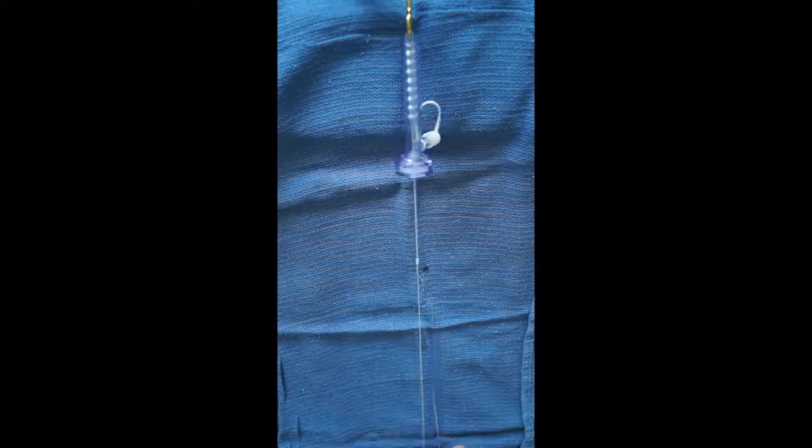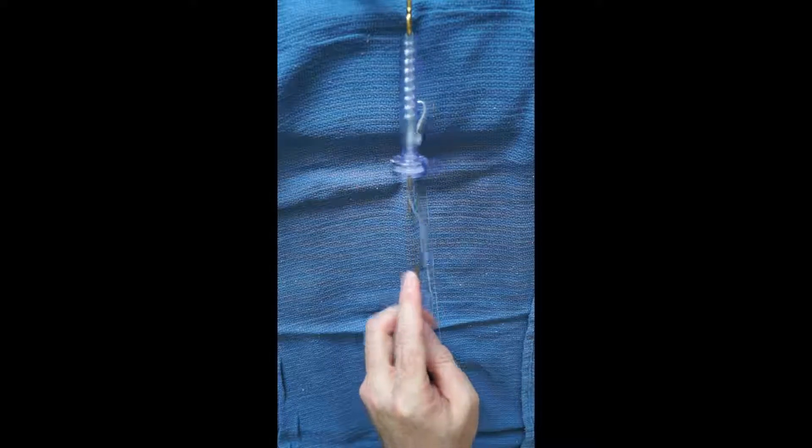At this point the knot is secured; however, additional alternating half hitches can be thrown to back up the knot if needed.